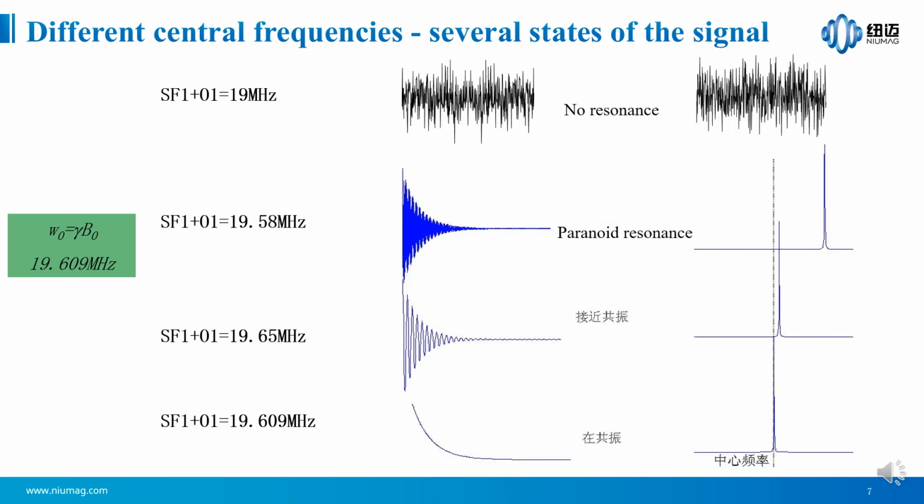Now let's look at the state of the MRI signal at different center frequencies.